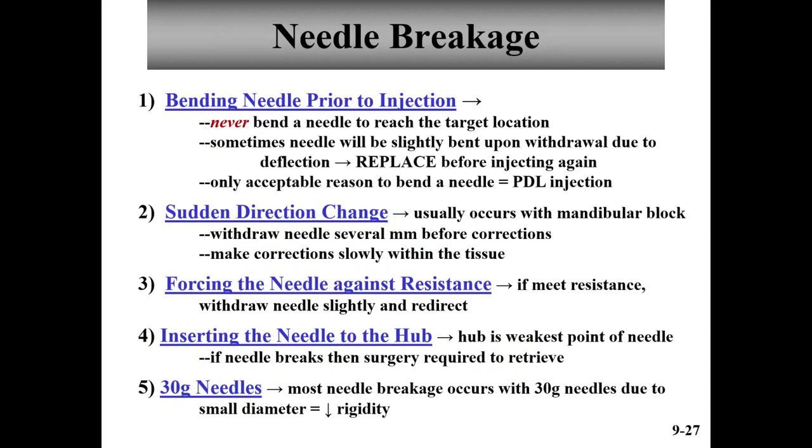Needles can break. You should never, ever, ever bend a needle prior to injecting. You may have doctors that say, oh, we'll just bend the needle. Don't do it. When you bend the shaft of that needle, you're weakening the needle. And if a needle breaks because you bend it, I guarantee you in a court of law, you're going to lose. You should never, ever bend a needle.